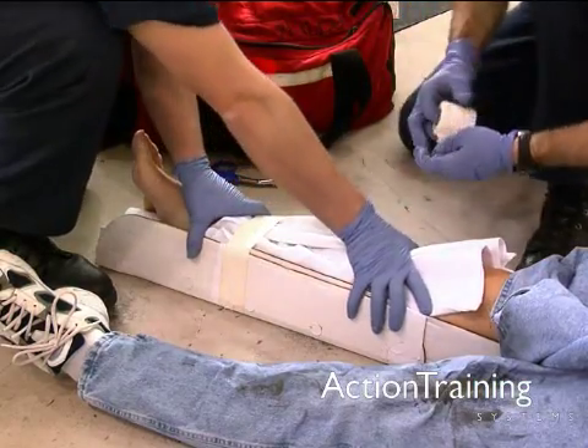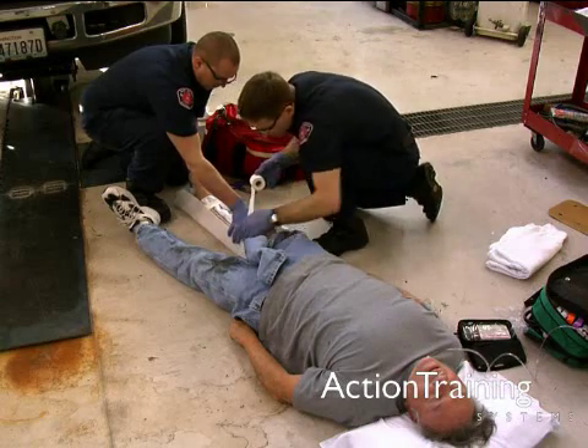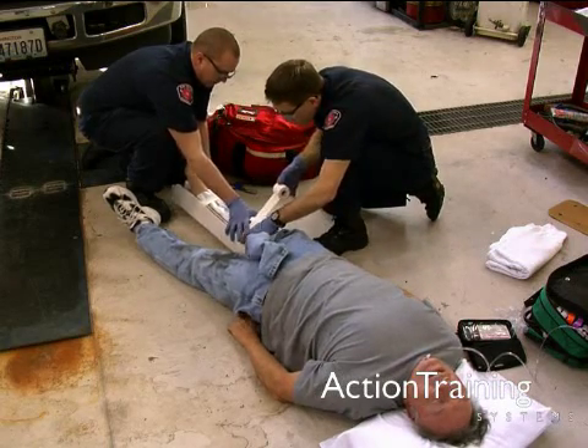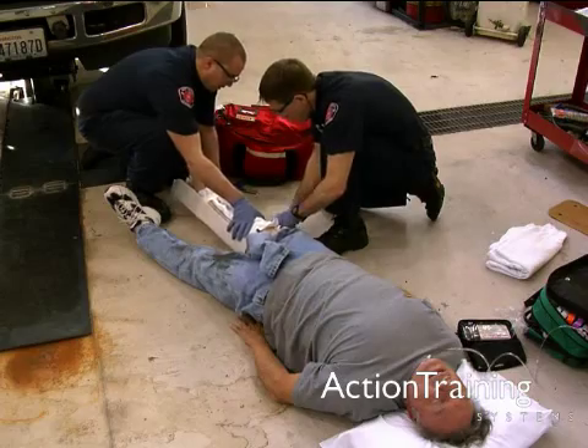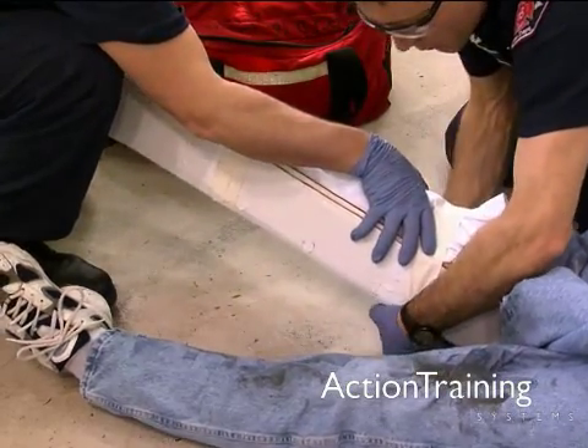Continue to hold manual stabilization. Secure the splint to the extremity by immobilizing the joints above and below the injury and elsewhere, as indicated by the manufacturer's directions or per local protocols.